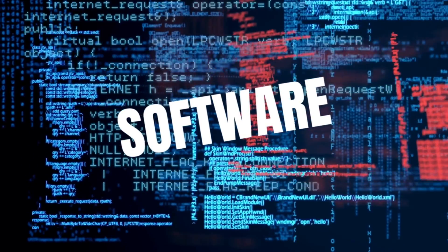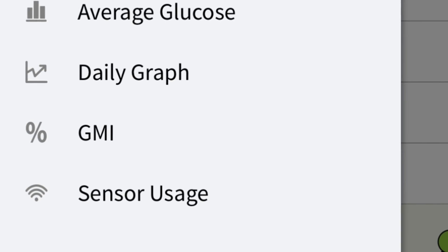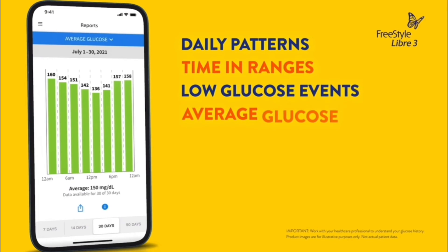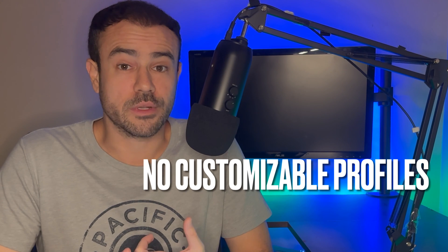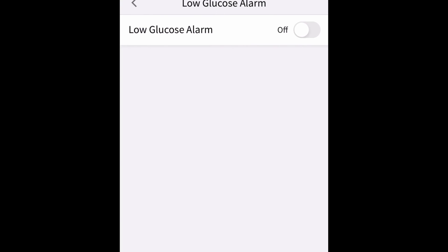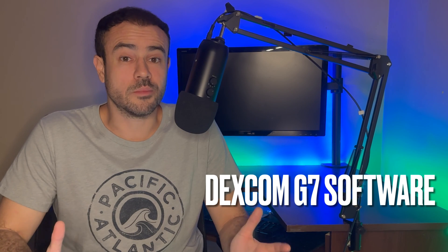What about the software? Starting with the Freestyle Libre 3 — if you've used the Freestyle Libre 2 or the Freestyle Libre 14 day, the software is essentially unchanged. The only discernible difference I could find is the addition of a GMI tab. The Libre software has always had tons of data: daily patterns, time in range, low glucose events, average glucose levels, and daily graph. But where the app is still lacking is in alarm flexibility. With the Libre 3, you don't have the ability to set different profiles for different times of the day, you can't repeat alarms after a set period of time — essentially, all you can do is set high and low alarms, and that's pretty much it.